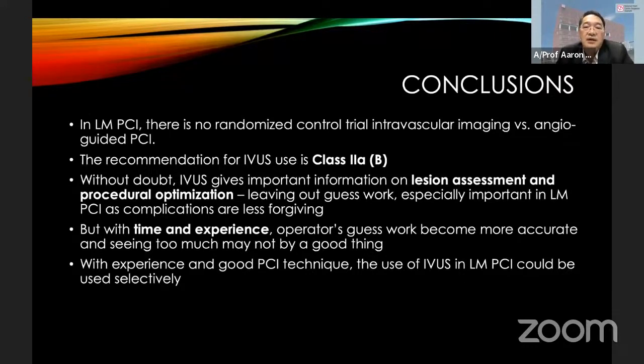It leaves out guesswork, especially important in left main PCI, as complications are less forgiving. But with time and experience, I think operator guesswork can become more accurate. And sometimes seeing too much may not be a good thing. So with experience and good PCI technique, the use of IVUS in left main could be used selectively, not in all patients. Thank you.